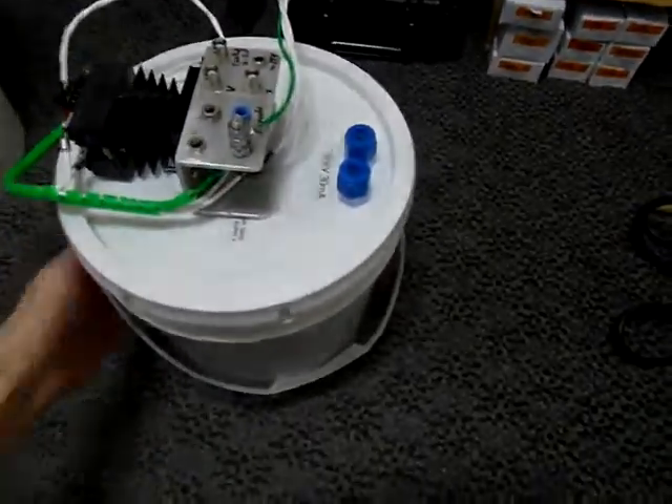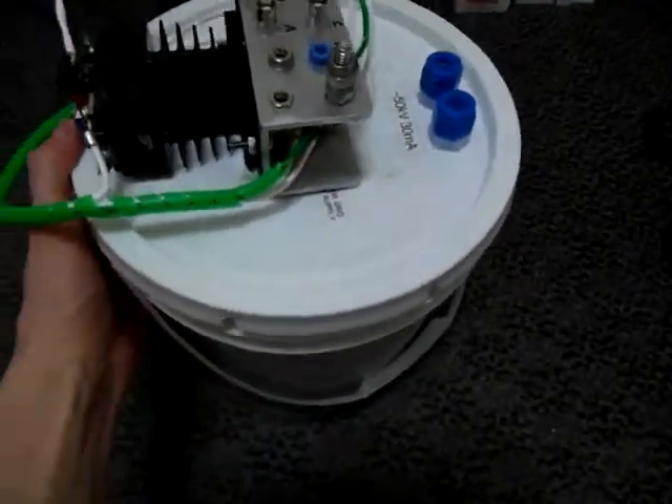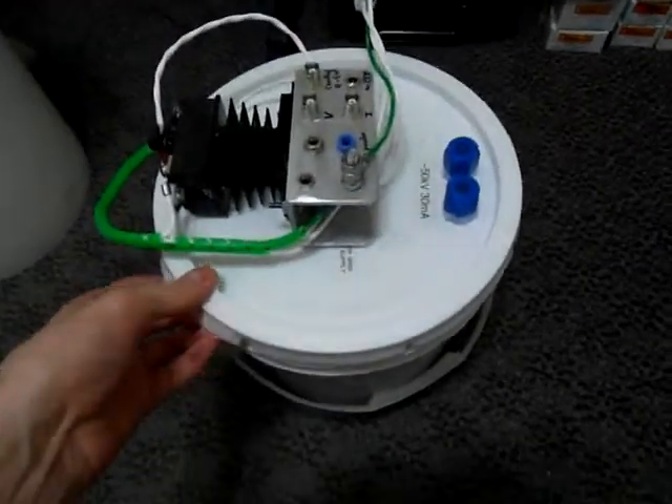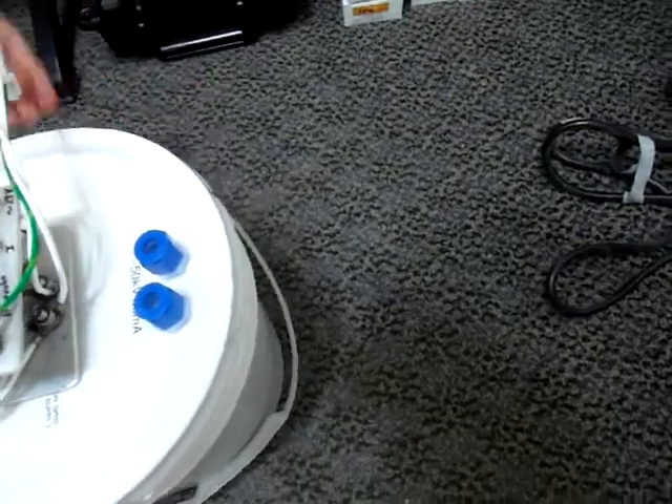Inside the high voltage transformer. The high voltage transformer is housed in a plastic bucket which is filled with mineral oil for insulation. The top of the bucket is held on by a snap lid which can be easily removed for inspection or servicing.